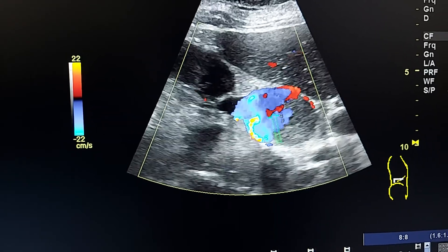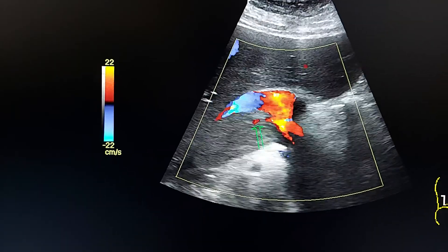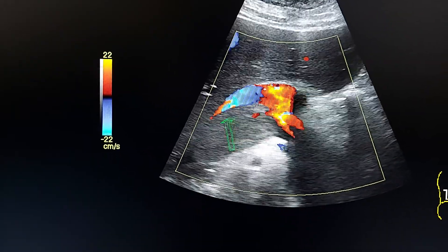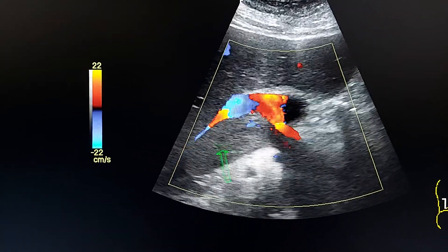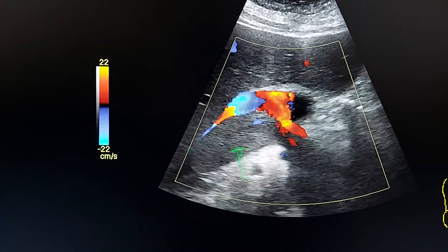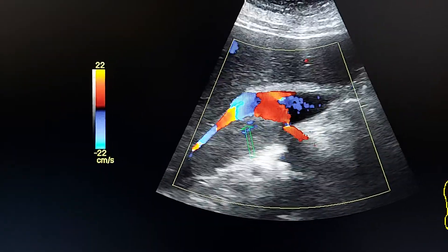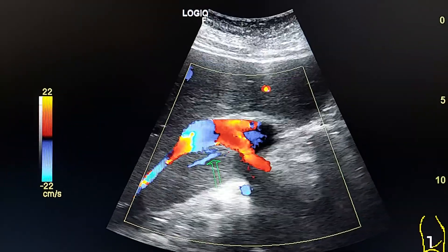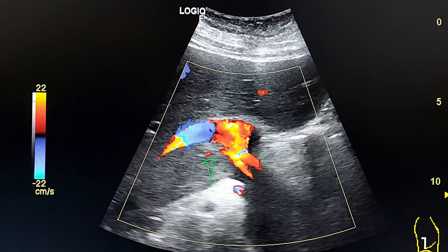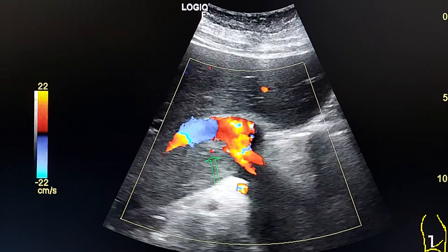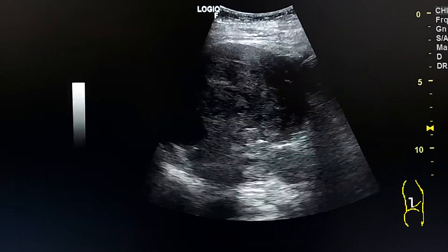The mass obstructs the IVC and distends it. By color Doppler, we see internal vascularity in this lesion. This confirms that it is not a bland thrombus inside the IVC, but a tumor with stasis inside the IVC. This confirms that the mass is malignant — most likely renal cell carcinoma — so we have an advanced stage renal cell carcinoma.